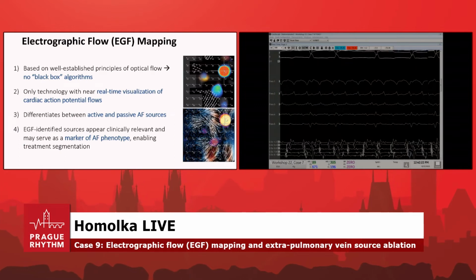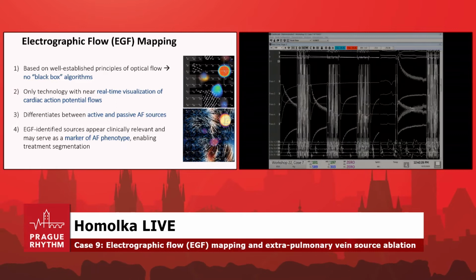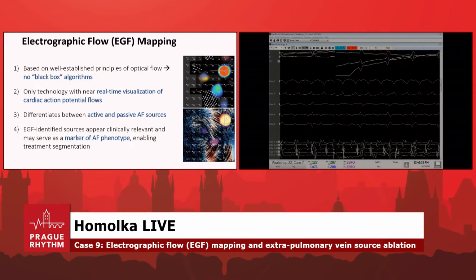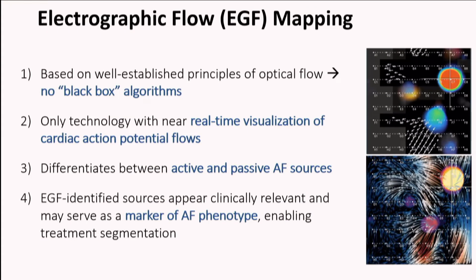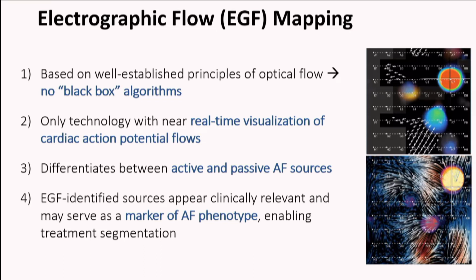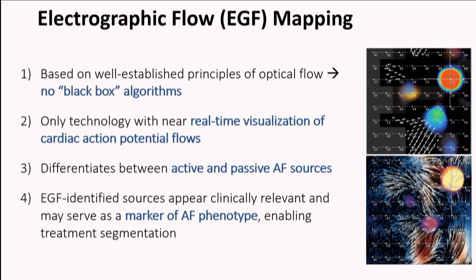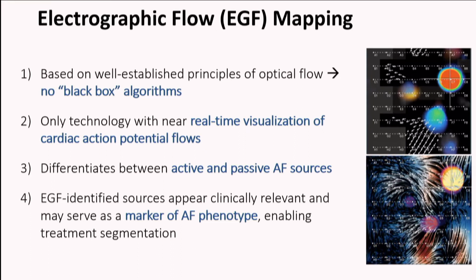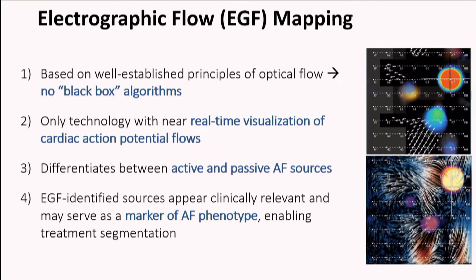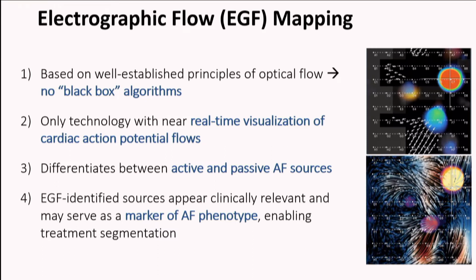So how does EGF mapping differ? Well, it's based on principles of optical flow, and we'll talk about what that is in just a minute. It's a technology that uses near real-time visualization of the action potential flows, because we're using a global mapping with this basket catheter. It also has the ability to differentiate between active sources and passive rotations, and we'll talk about that. And it appears to be clinically relevant. Obviously, the clinical studies are still being done, so we can't say things definitively, but certainly it's promising.